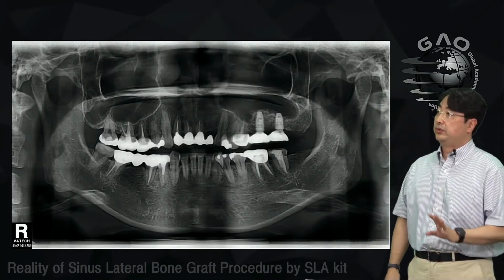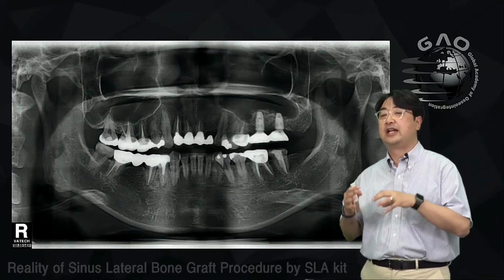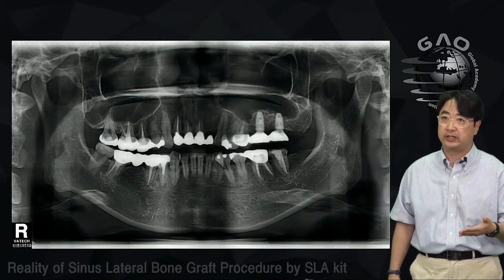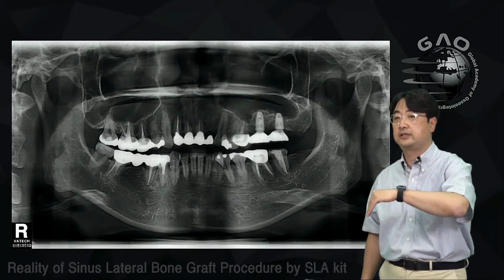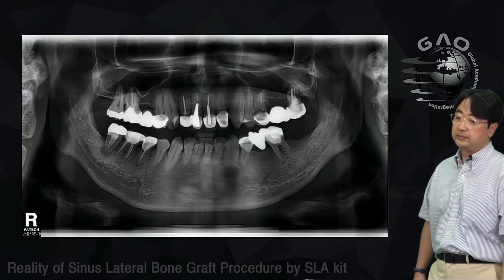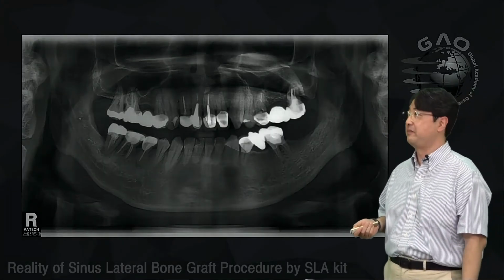Well, so if you have a perforation, you have to consider it exposed and dissect not from the crestal, because you have a crestal opening already, right? So in those cases, you can use the lateral approach to help dissect the membrane and the tearing of the crestal area. Well, this is my last case today, right? So time goes very fast, and it's already been more than 30 minutes.